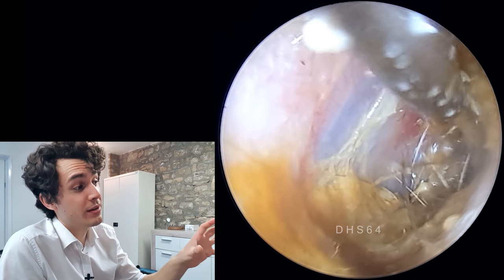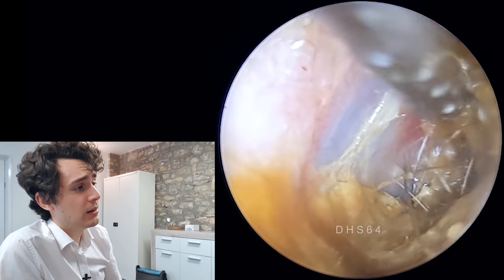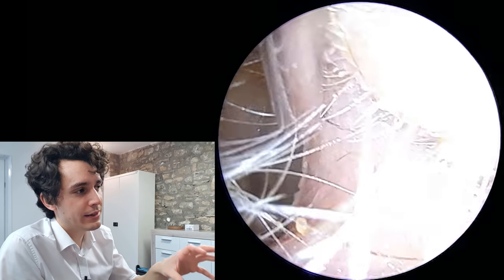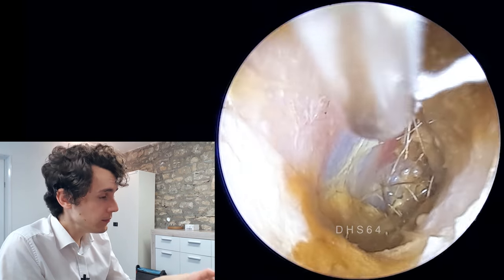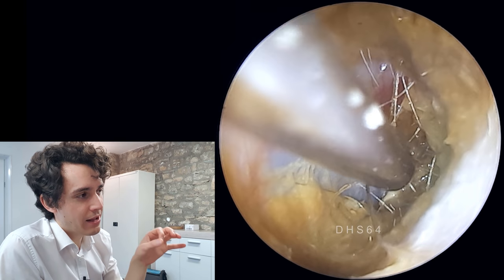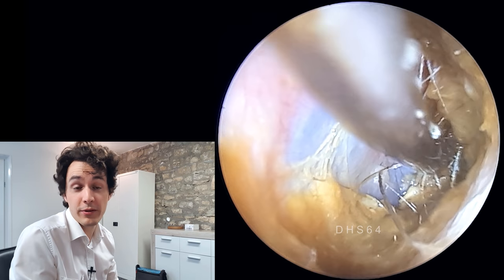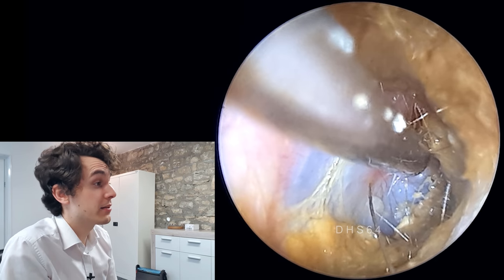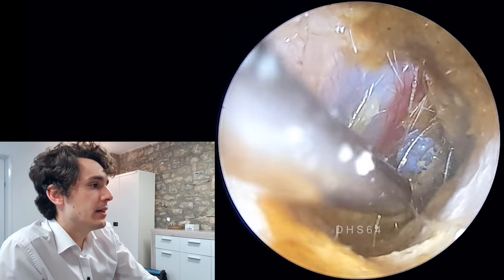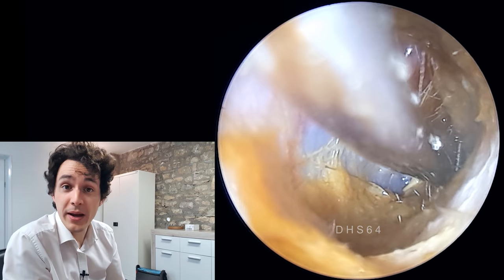We won't be able to get all of it because it really is very deeply encrusted into the recess just before the eardrum. But we will be able to achieve enough of a clean such that it will restore the patient's hearing. So we're going in again and I'm being extremely careful. At this point the patient is able to sit still without fidgeting, but there is more fidgeting to come, so I will have to irrigate one more time. It has actually softened some of the wax, which is to be expected — water is a cerumenolytic.